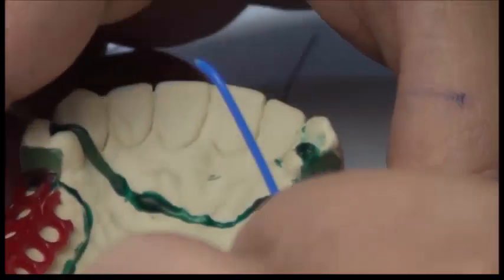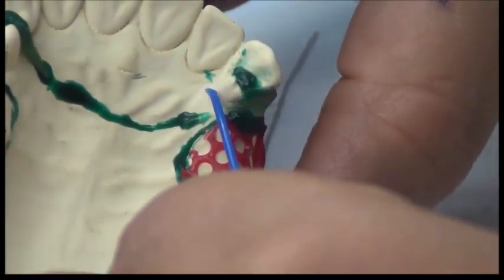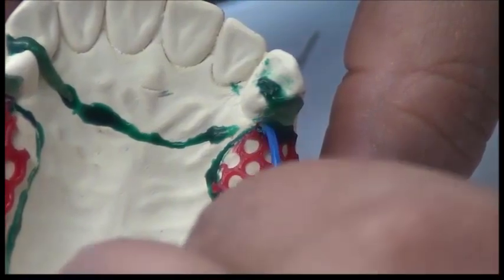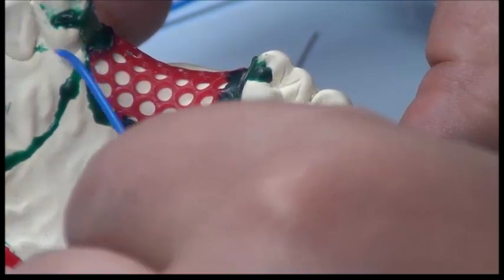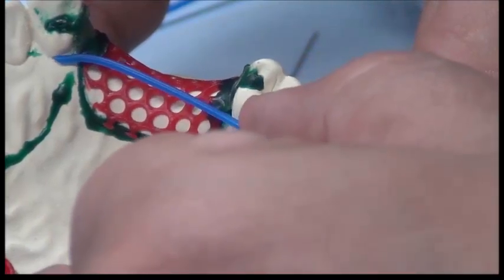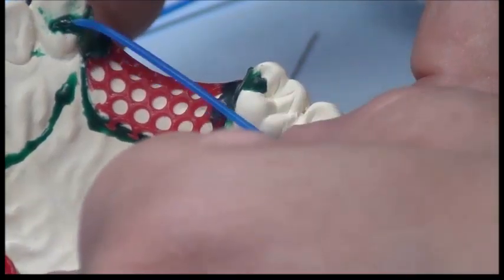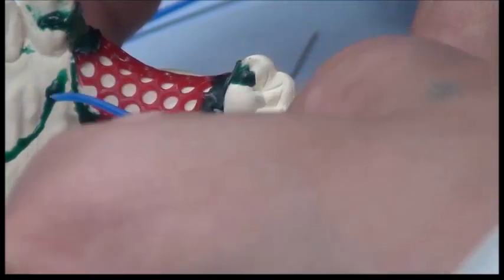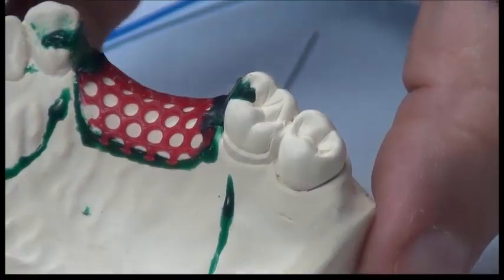Okay? So, if I'm going to first imagine where will be the marginal gingiva of these teeth, the marginal gingiva of the artificial teeth added here will be somewhere like this. This is the marginal gingiva of this tooth, and this is the marginal gingiva of this tooth. They will be almost like this, in between here. Okay? So these are the new teeth that I'm going to add. Now my external finish line should be between this line and the internal finish line. So it's more occlusal than the internal finish line. This is where I'm going to add it.